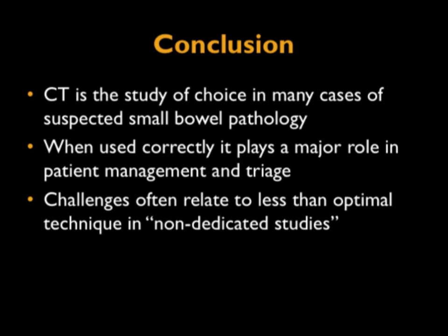So in non-dedicated studies, you might be doing 3x3s or 5x5s. You don't worry about timing. You were looking for a rule out anything, or maybe pancreatitis, or maybe appendicitis. So you need to be very careful when you do these studies. You have to do them right the first time because you're going to have to go back, and doing them right will, in the long run, decrease patient's dose.